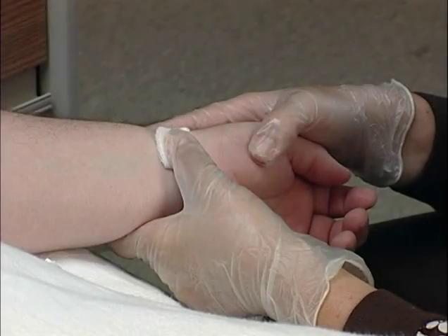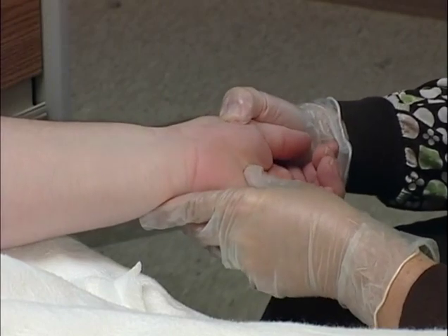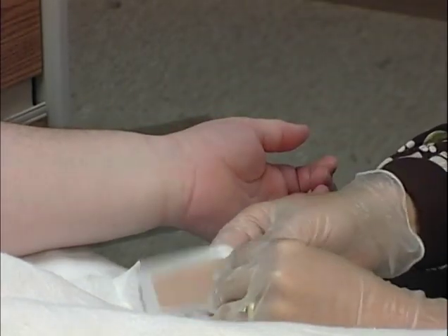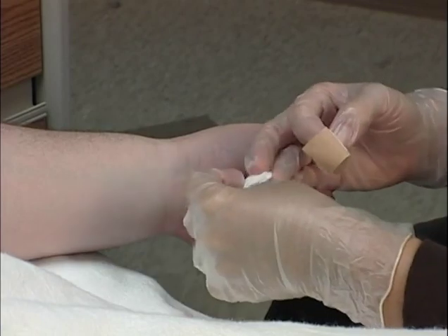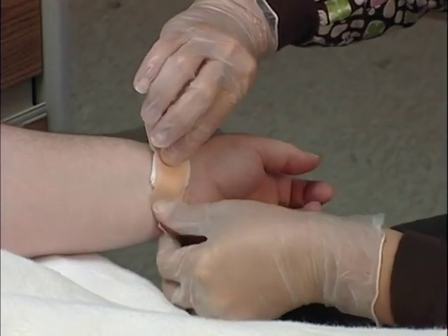Apply firm pressure for a minimum of 3 to 5 minutes for radial punctures. For brachial draws, at least 5 minutes of pressure are required. Observe the puncture site long enough to be assured that bleeding has stopped both superficially and subcutaneously. If bleeding continues, reapply pressure for an additional 2 minutes and reassess. Continue this sequence until hemostasis is achieved.